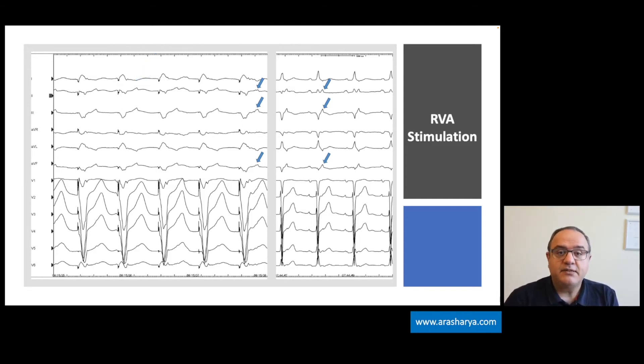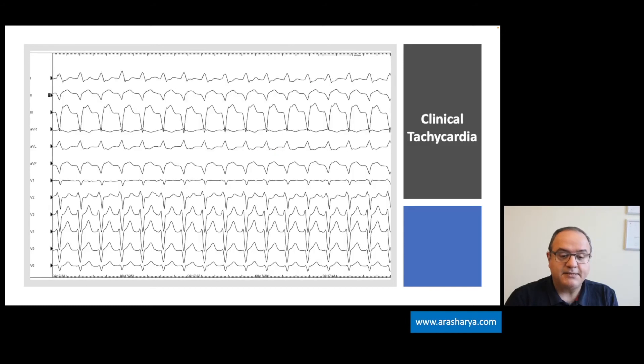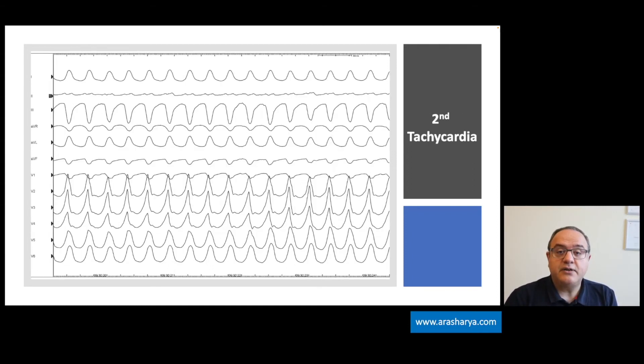Now this is the clinical tachycardia of the patient. Besides from negative concordance, the clear AV dissociation in lead V2 especially is compatible with the diagnosis of ventricular tachycardia. And as you can see here, like almost all the patients with scar-related VT, not only clinical VT but some additional tachycardias are inducible.